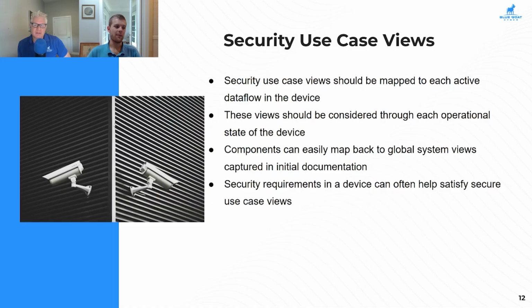That's a great question. And DICOM's specifically a really difficult problem to cover due to the fact that it's such an old format and it has so many inherent vulnerabilities that can be a little bit difficult to bridge even with modern technology. When we're looking at something like that, the general rule with data flows and transfers is validation and verification on every end of the transfer. We want to verify that the information we're sending out is correct. So before it leaves and is in that active data flow state, when it's at the data store at the beginning end, we want to verify on the receiving end that we are receiving what we expect to see.